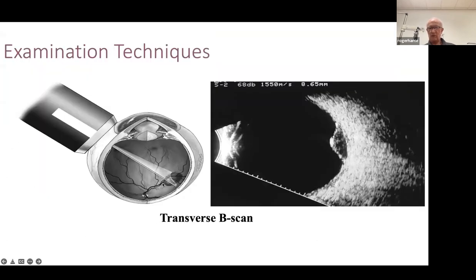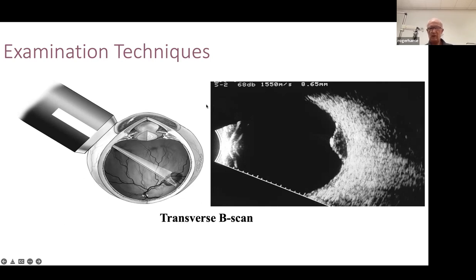When you look at a lesion — here's a choroidal lesion, probably a melanoma — this is a transverse position. The sound beam is going side-to-side, so you're measuring that dimension horizontally. Here's the lesion displayed on the screen. The mark on the probe, whether it's white or other marks, orients it. When displayed on the screen, that mark is shown at the superior part of the screen. So the mark on the probe orients you to which way is up on the screen.